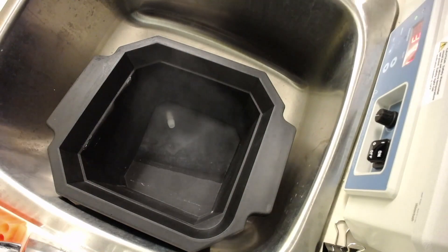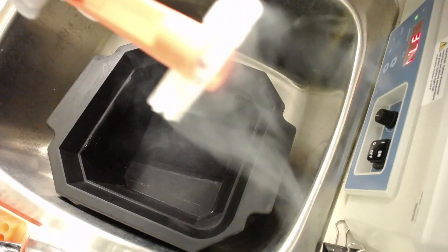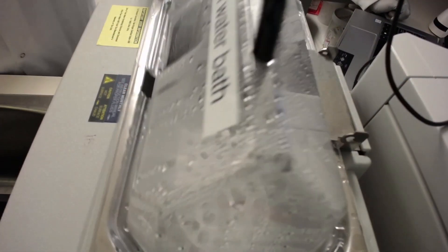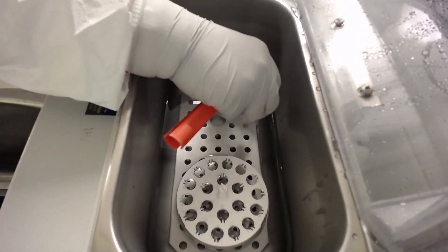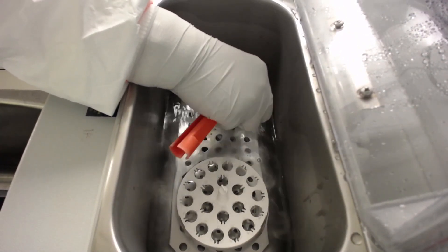Using forceps, carefully remove the cryovial from the container and transfer it to the water bath. Start thawing the vial by gently shaking it inside the 37 degrees Celsius water bath. Be careful to not wet the cap of the cryovial.